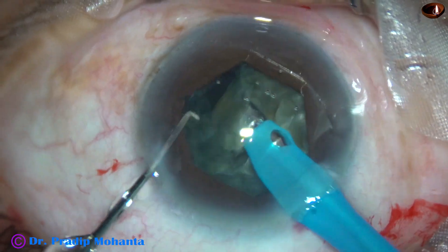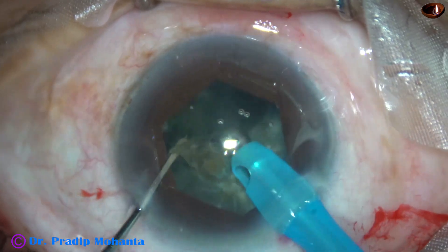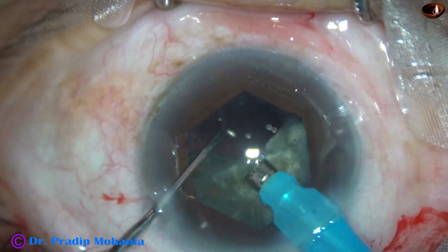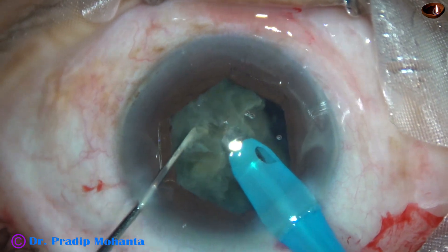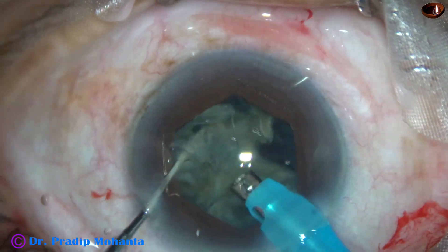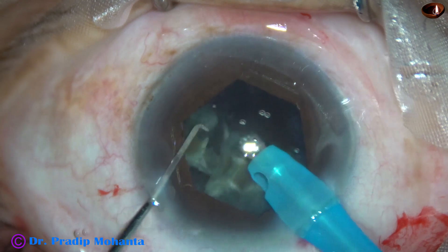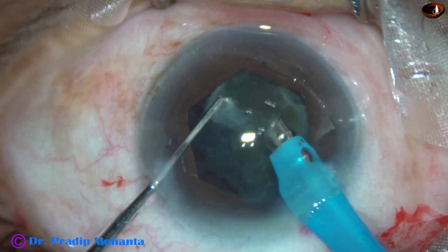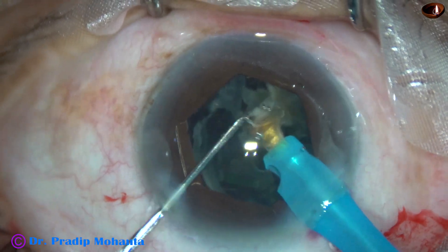Each large fragment is emulsified with ultrasonic energy. The machine I have with me today is Faros from Oertly, Switzerland — it is a beautiful machine. It has got SPEEP mode. After cracking the nucleus into fragments, I am using the SPEEP mode. S-P-E-E-P mode.